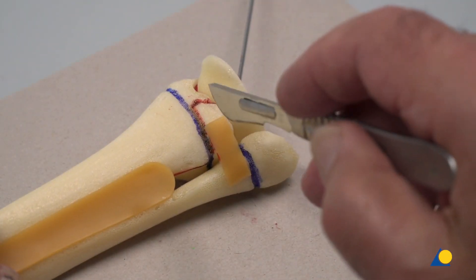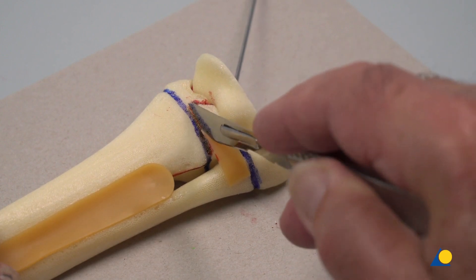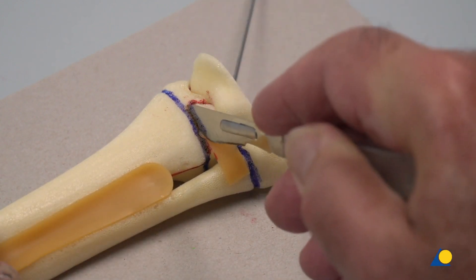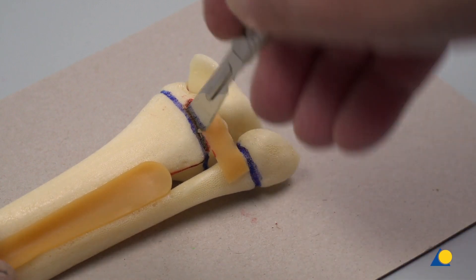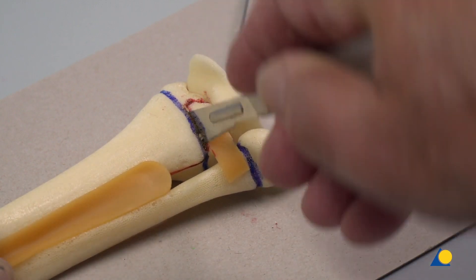An epiphysial cut is created from the medial to the lateral side. During this procedure, care must be taken to protect the bone model from destruction.